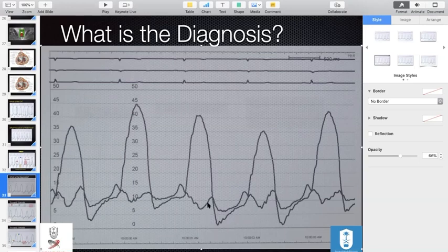What happens? Then you want to look at the pathologies. What's going on? You look here. It is normal that you see a difference between the systolic RV and the atrial pressure tracing. So that's not a problem. The problem is here. They should be equal and overlap. Here, it's not the case, okay? So you see there's a gradient. So there must be an obstruction at the level of the tricuspid valve.